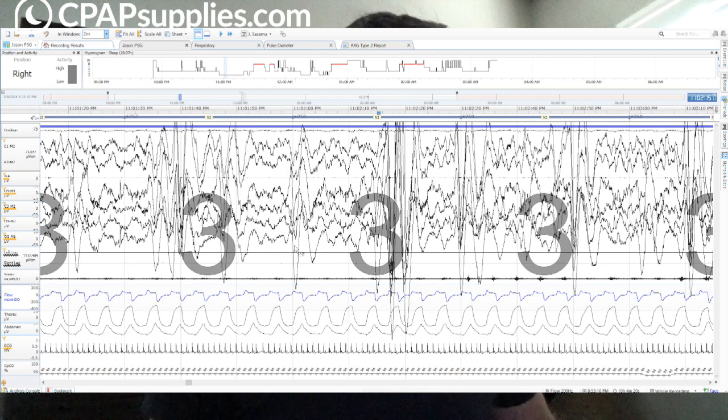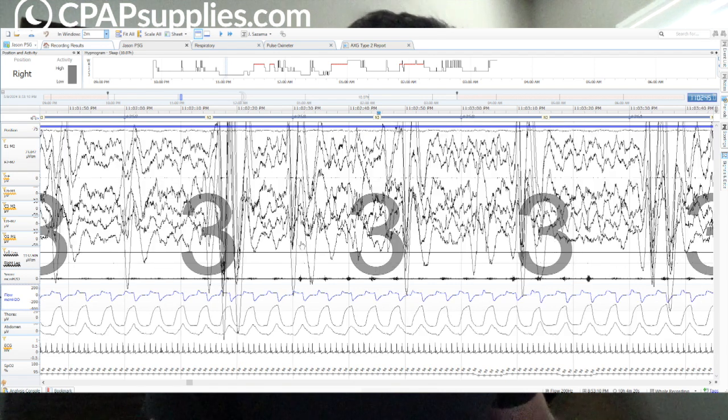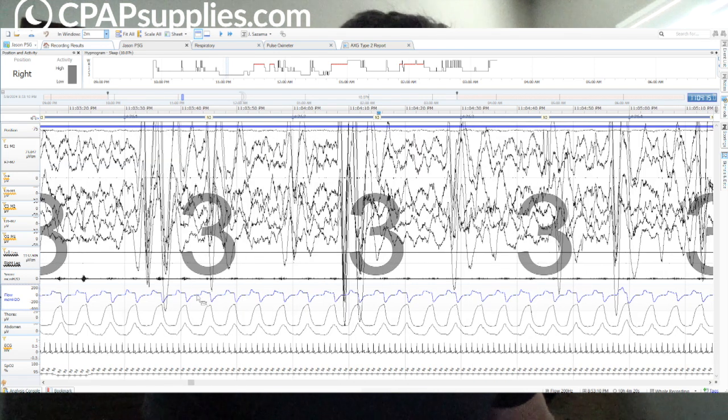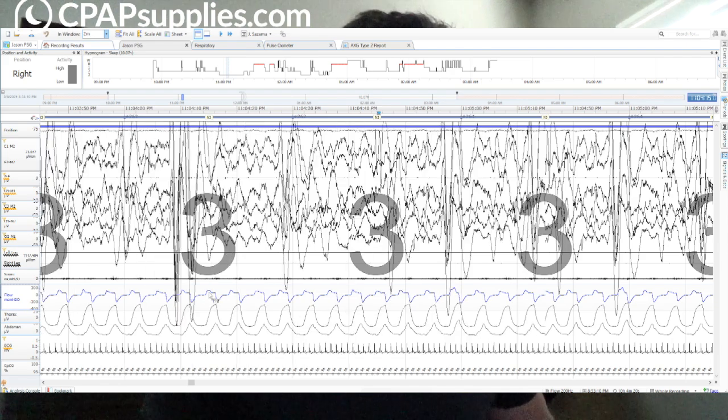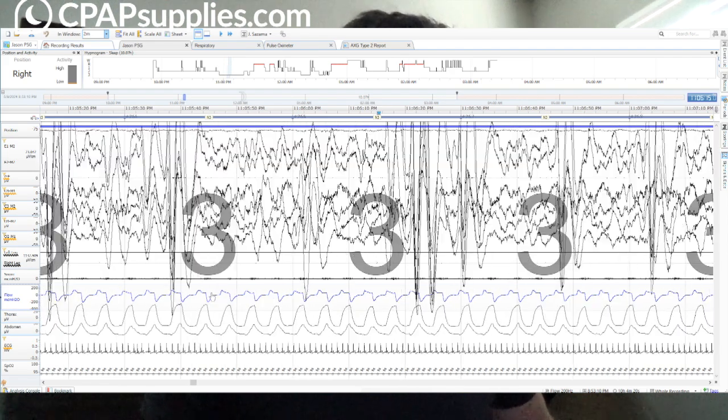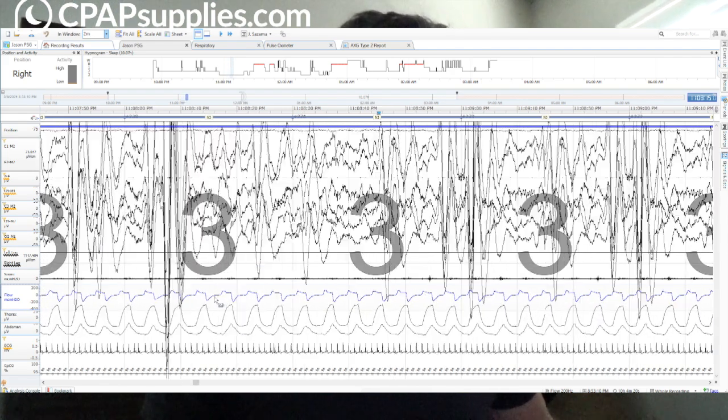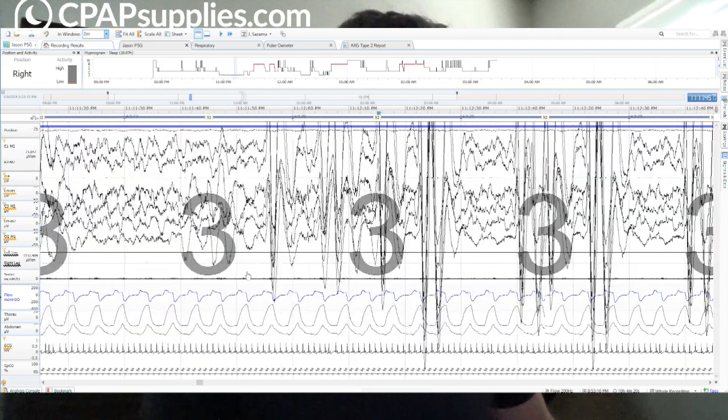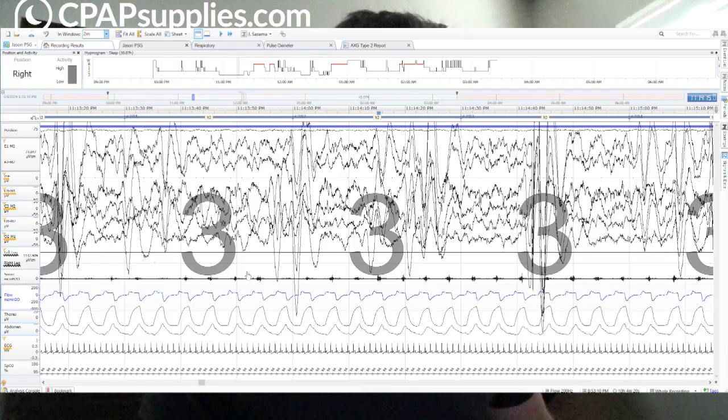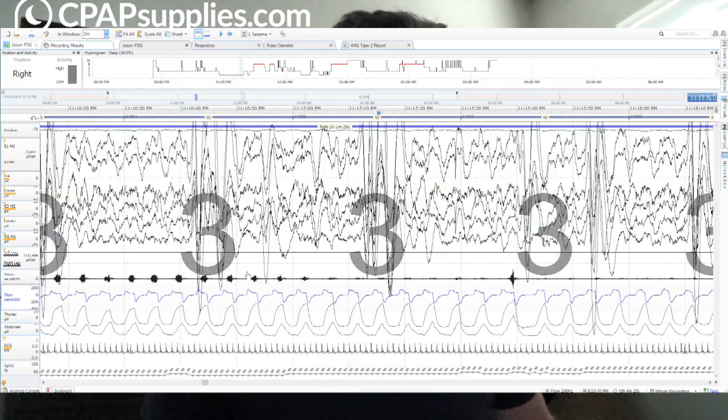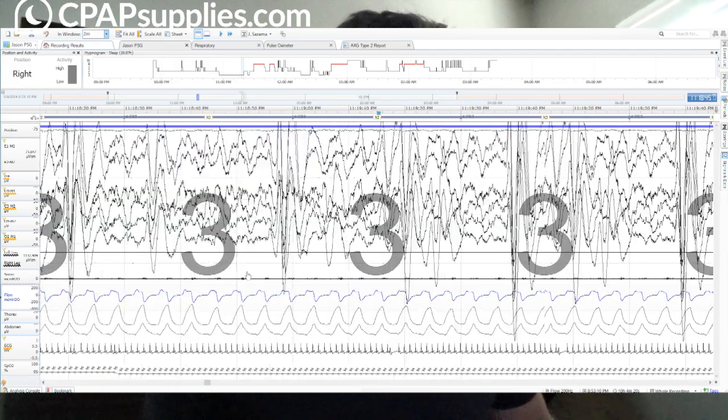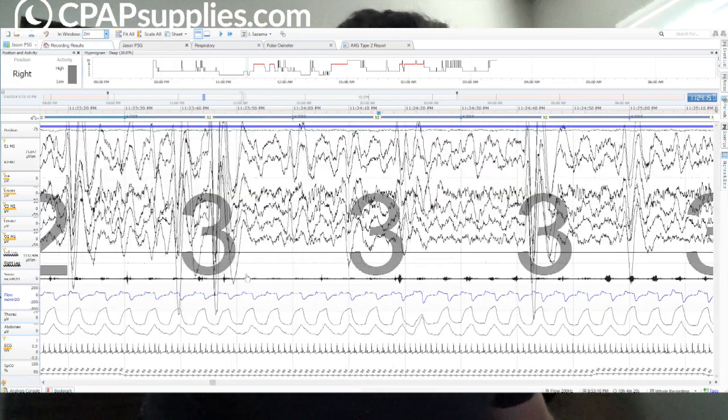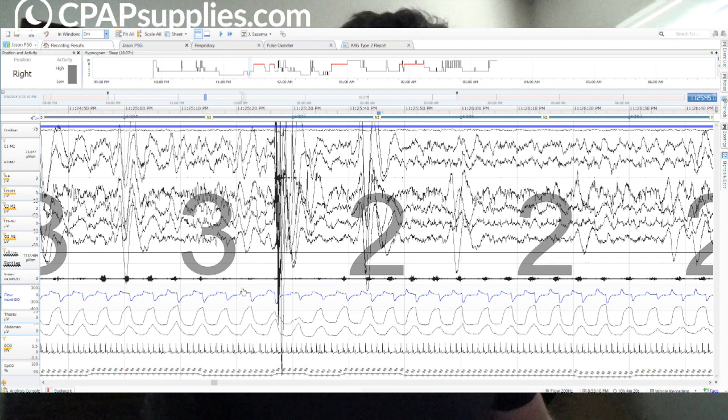So I'm going to expand this again to two minutes. And we're going to cruise along. Now, the interesting thing is during delta sleep, oddly, oftentimes, sleep disorder breathing goes away. Kind of a curious thing. Even if you're really severe on your back, if you're on your back in delta, it doesn't look so bad. But then you go into stage two or REM and it's like horrid.